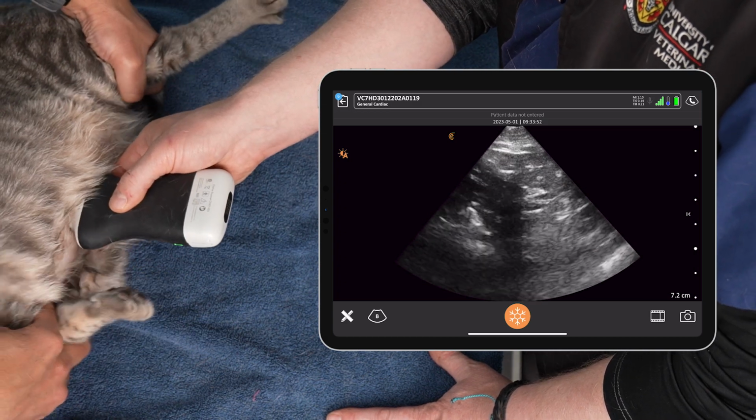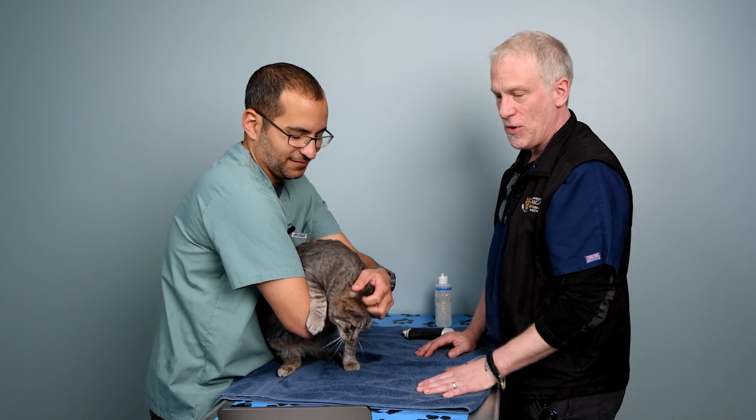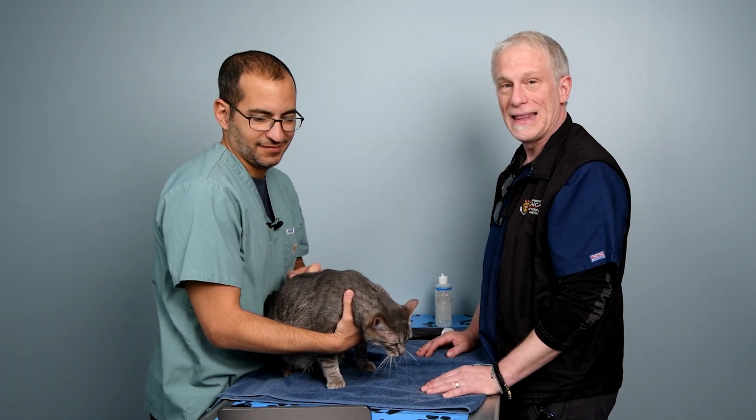And in Daisy here, we don't really see the spleen, so we can't see that in all of our cats because the spleen is very mobile in our feline patients, but those are the questions we look for, ask and answer at that umbilical site.